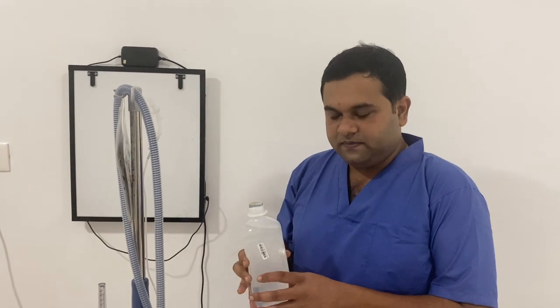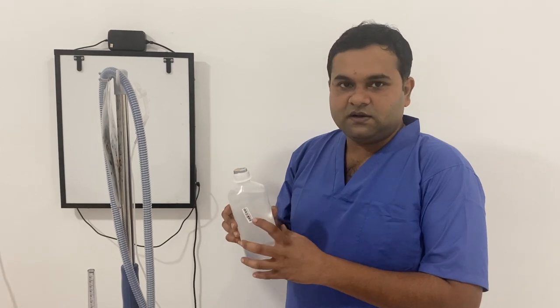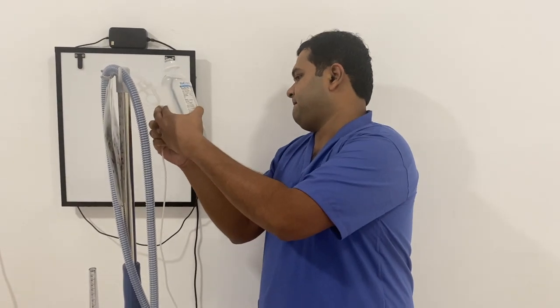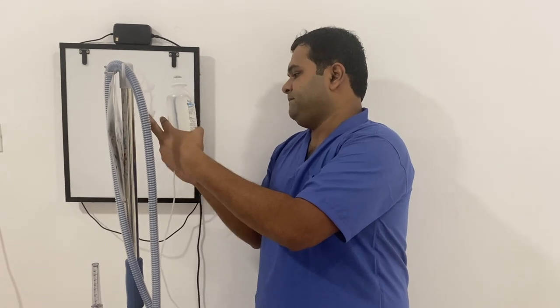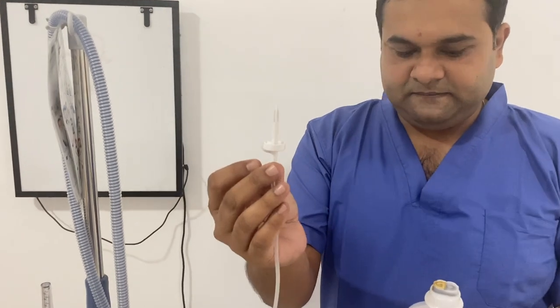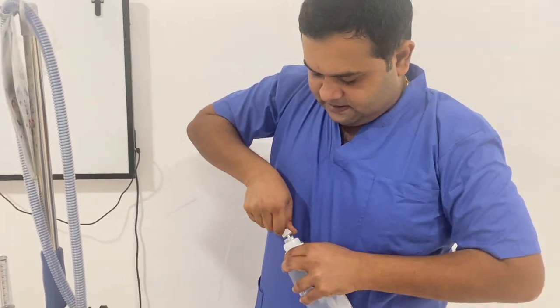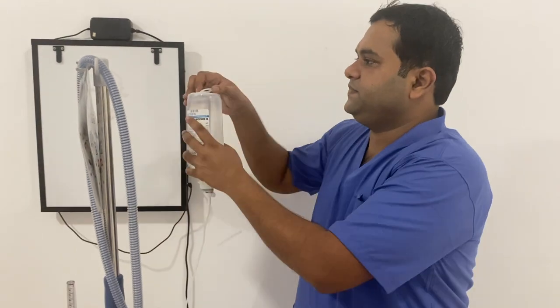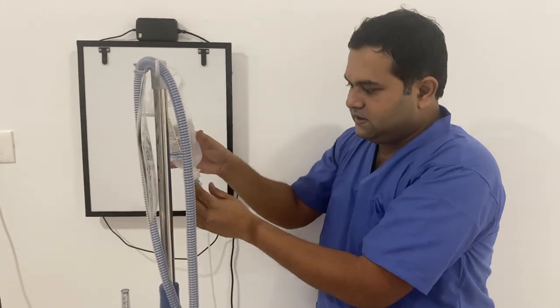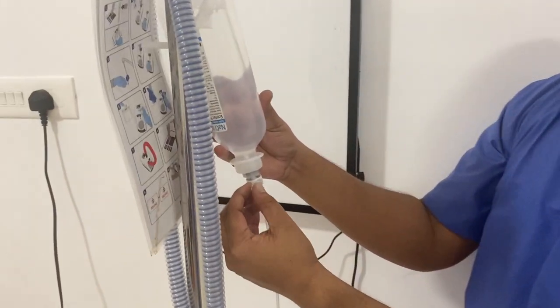So this is our water bag. This consists of distilled water — we have 1 liter of distilled water. This is the connector, similar to an IV set. This is hung over here. The air chamber is opened up and has to be kept open.